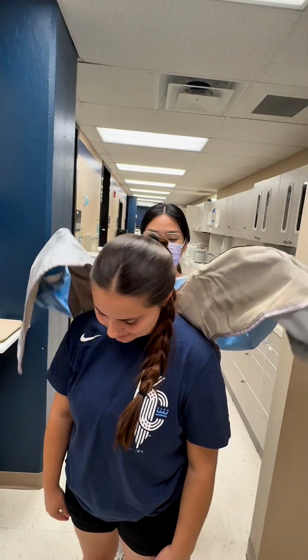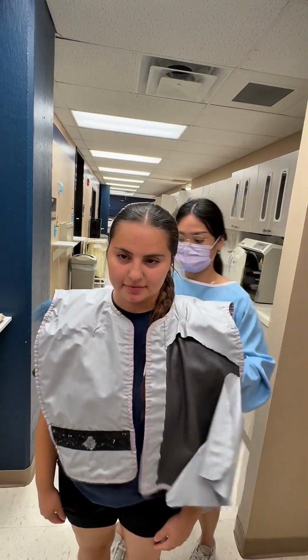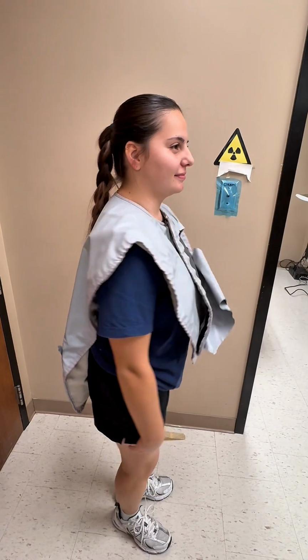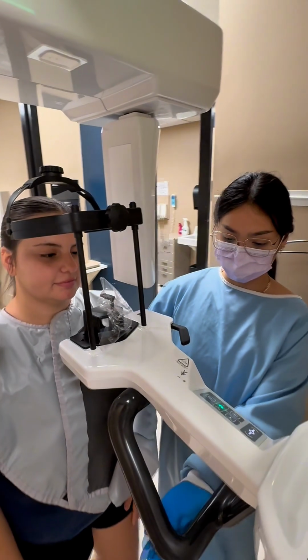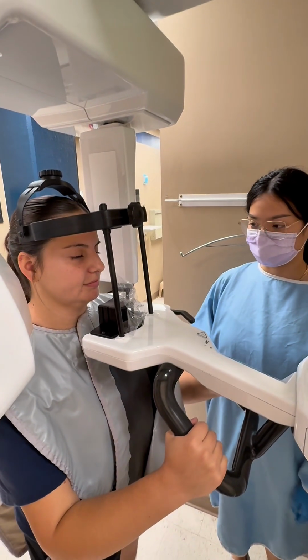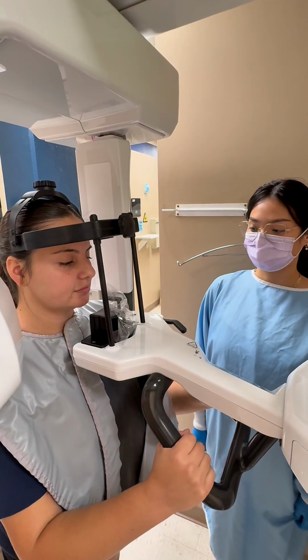The lead apron should remain slightly open in the front to prevent potential projection onto the image. The lead apron should not overlap in the front as seen in this video. Guide the patient into the machine, raise or lower the machine as necessary, and instruct the patient to grasp the handles, stand up straight, and hold still during the exposure. If the PID interferes, have the patient take a few small steps forward.